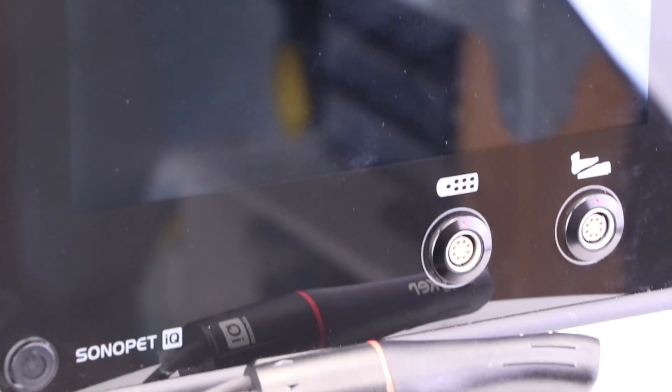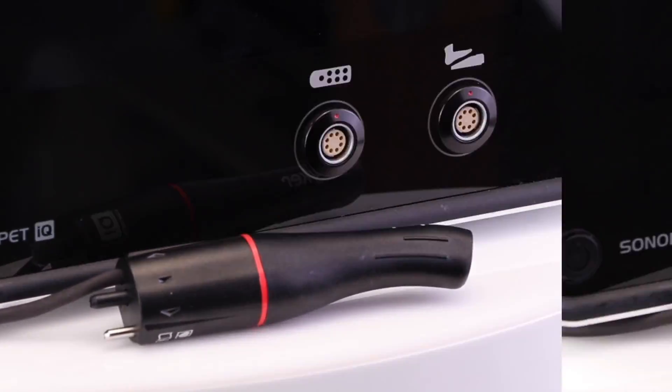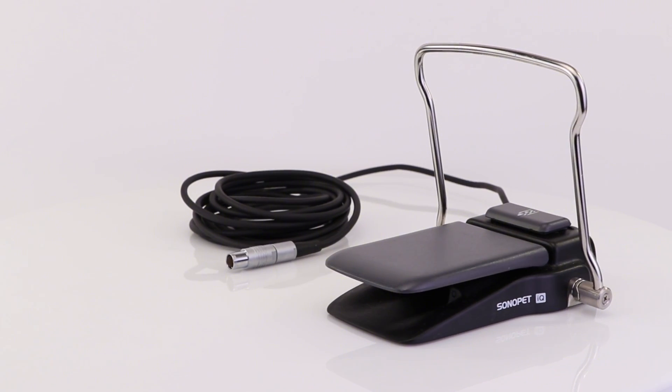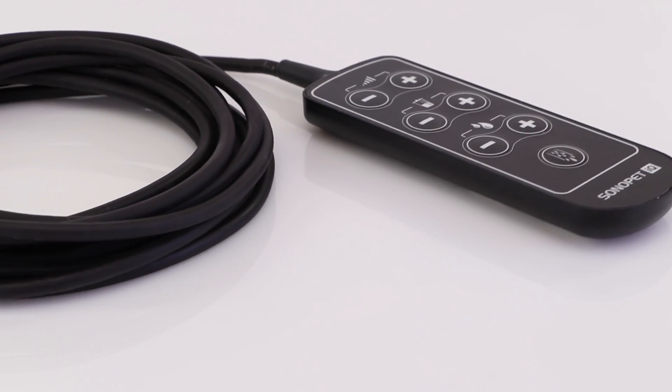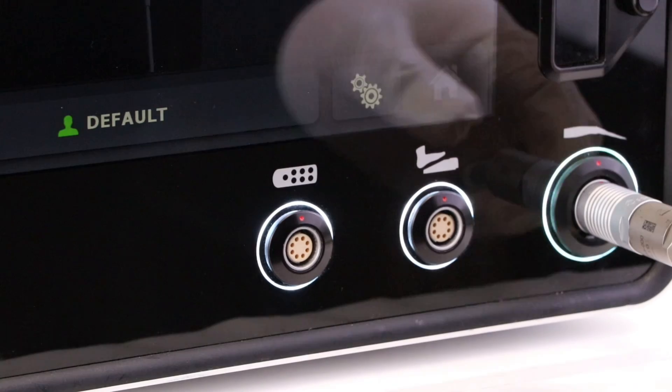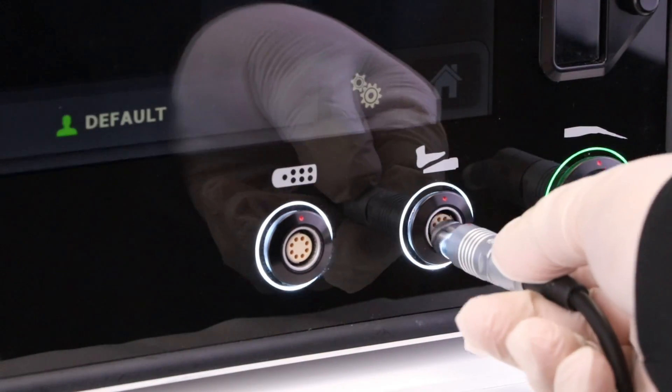When Stryker decided to upgrade the Sonopet system, they wanted to deliver even more of what the customers loved. They focused on simplicity and reliability to aid in consistently excellent OR surgical experiences. They also added semi-autonomous functionality and customization so you can do more with less time and effort.